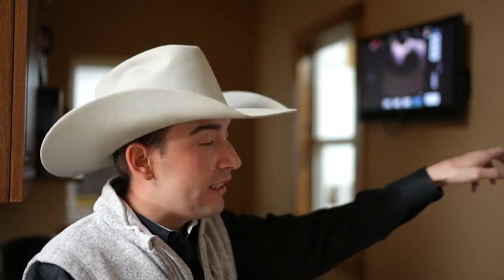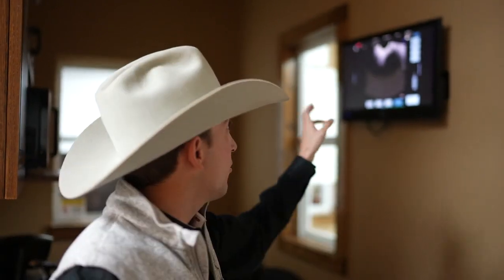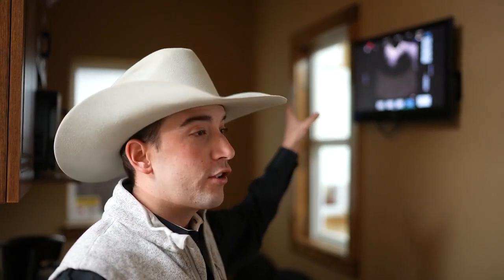We do that through an ultrasound guided needle. The technician will palpate the cow rectally to manipulate and maneuver the ovary. The ultrasound guided needle will go in vaginally, and the technician will move the ovary up against the ultrasound, and that's where we're gonna see these follicles up on our screen here, and you'll see the needle going into the follicle and retrieving those oocytes.